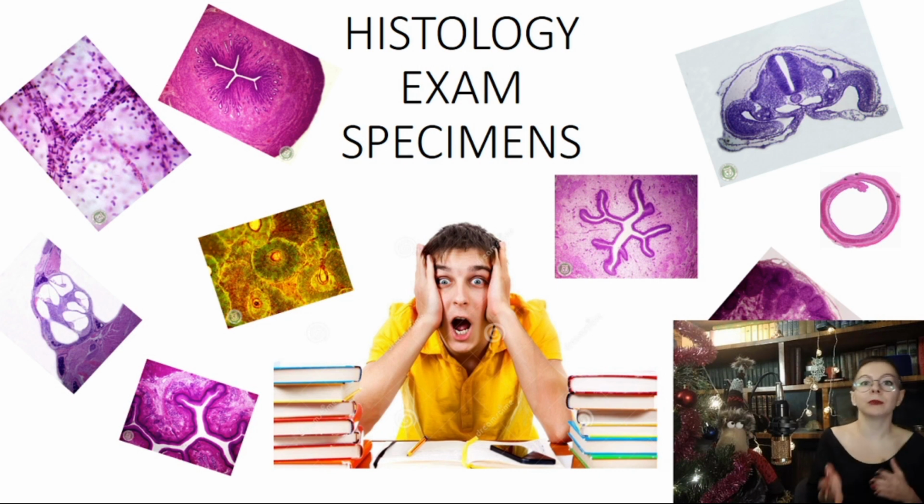You should study them separately, using our website. There is an atlas with many images in it, and also in all our lectures there is an explanation about every specimen one by one. But this video is just to help you not to confuse specimens, to show how to distinguish them, so use this video after you prepare specimens with the help of the website and lectures. Okay, let's get started.